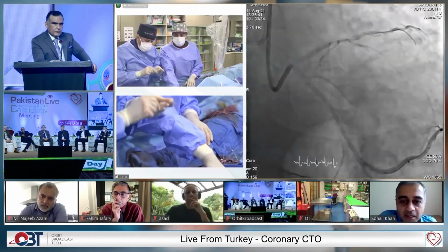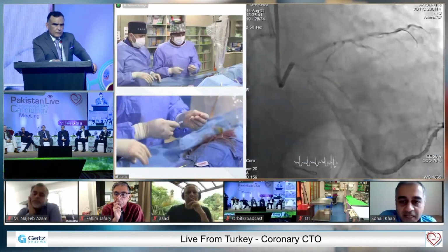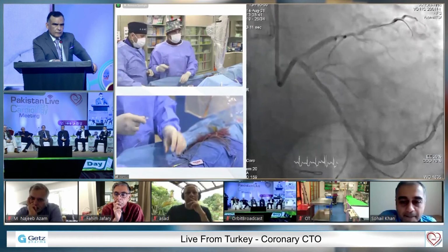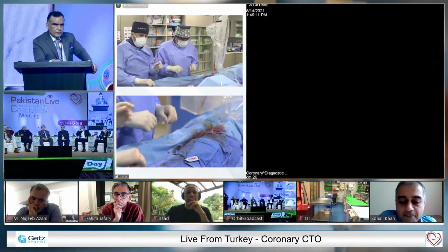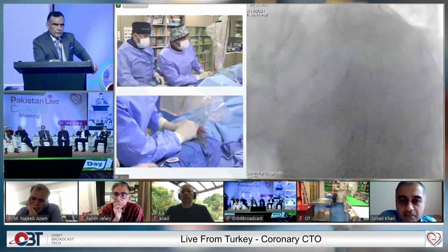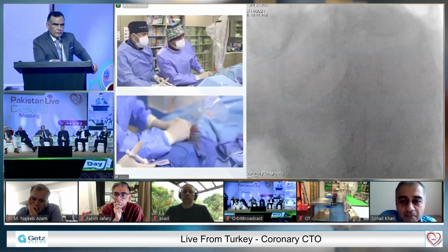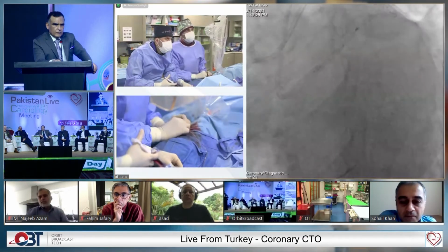Are you happy you're not just imaging into that other branch? Is that actually the LAD ostium that you're seeing on the IVUS? Yes. Okay, let's check it. It's easy to check when we give some injection. Yes, very good question. Let's see it now. Pull back a little bit, and I'm in. To me, I'm just at the junction. Let's see. Good, give injection, please, Ahmed.